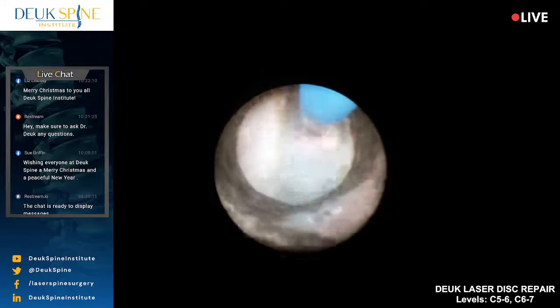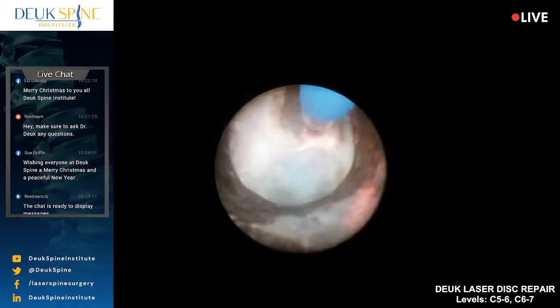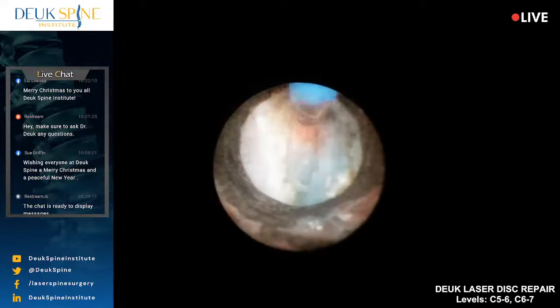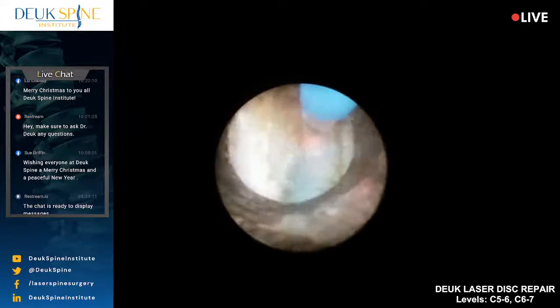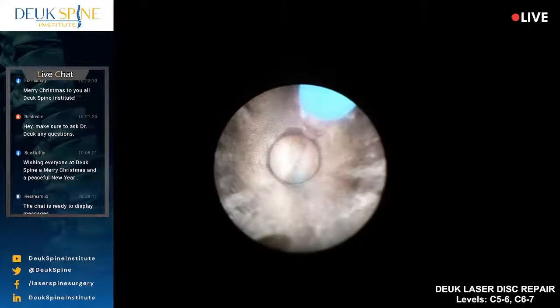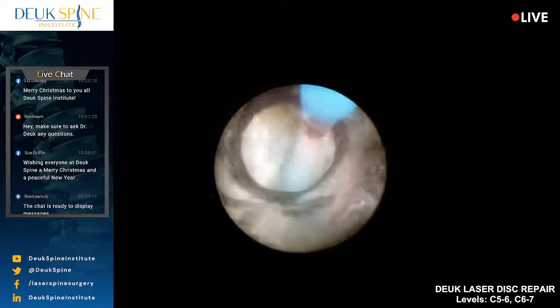I've just got to be really careful here. That's fibers of the posterior longitudinal ligament right there. Beyond that is going to be potentially the dura and the spinal cord. I don't want to get too aggressive here because I don't want to injure anything like the spinal cord or nerve root. So I feel I really did a good debridement at this point. I need to just check this foramen.